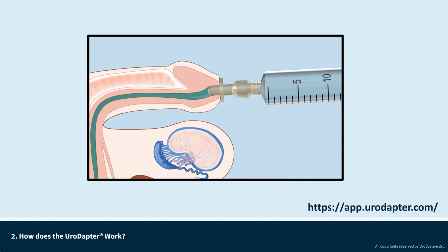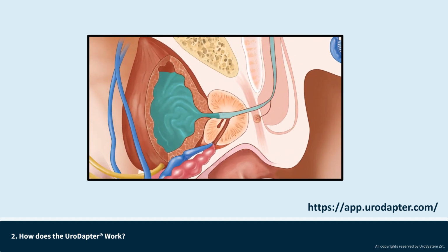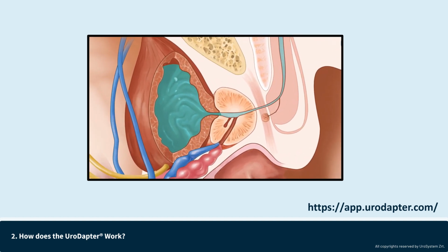Release the urethral compression and push the air slowly into the urethra. The instilled air bubble will push the remaining liquid into the bladder. This small amount of instilled air is completely harmless and will be emptied with the first urination after the instillation.